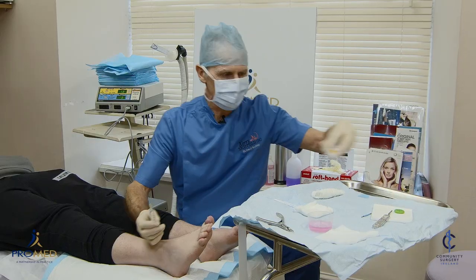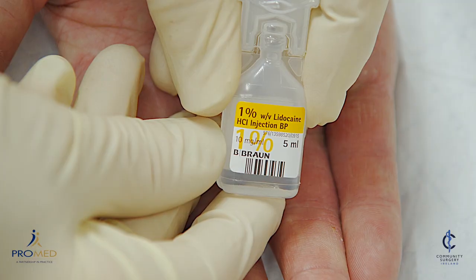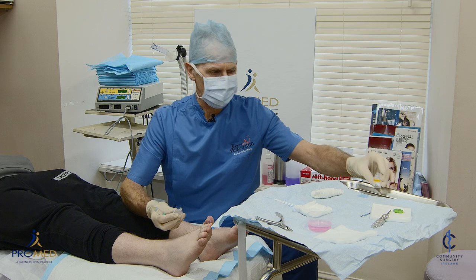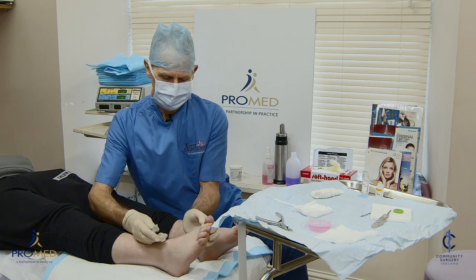What we use is Marcaine 0.5%, which is a long-acting anaesthetic lasting about six hours, and lignocaine 1% with no adrenaline, which is fast-acting and lasts about an hour. So you get the advantage of a quick-acting and a long-lasting anaesthetic, mixed half and half in the syringe.